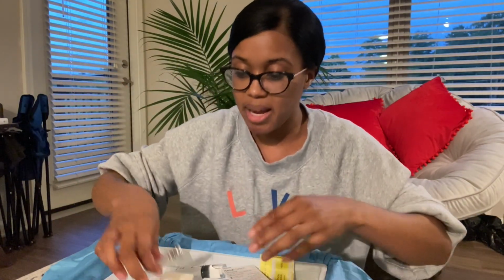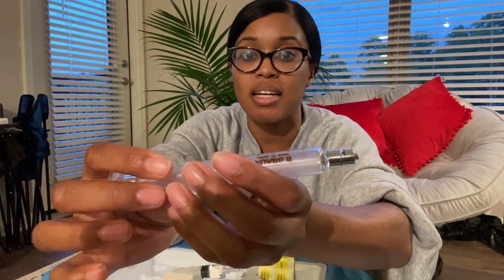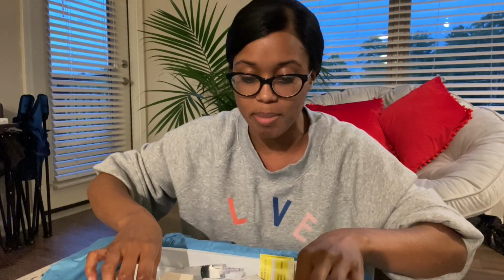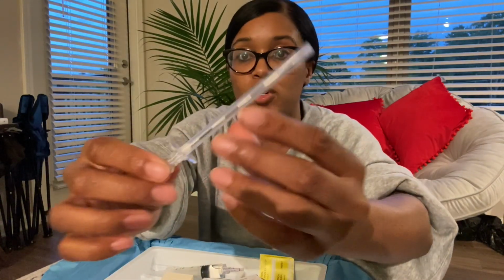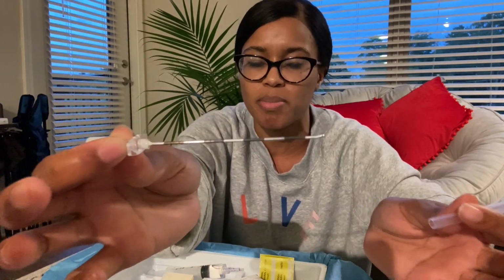And then what else do we have? We have, this is the loss of resistance syringe. So this helps us find where we are at when we are going through the different ligaments. And I'll explain that a little better. And then this is the epidural needle, and it has different markings so we can know how far through each of the ligaments we've gotten. And it just gives us an idea of how close we are to the epidural space in a way.